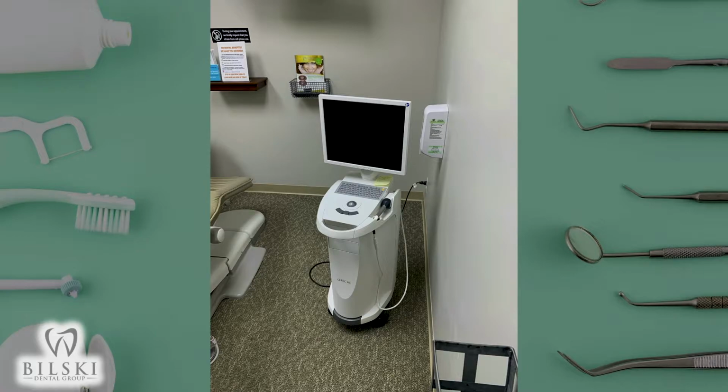Funny thing that we hear all the time in the office is that patients will come in and they need a crown. Sometimes patients know it as a cap. We use both terms. Whoever we're speaking with makes it easier for us to move forward. But what we do is we use a computer. And on that computer, there's a camera, which I don't know if you can see very well. It's that white cord hanging off to the right.